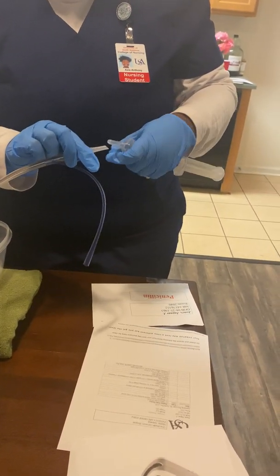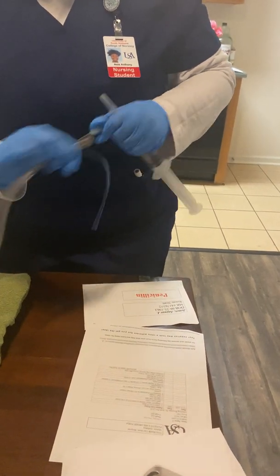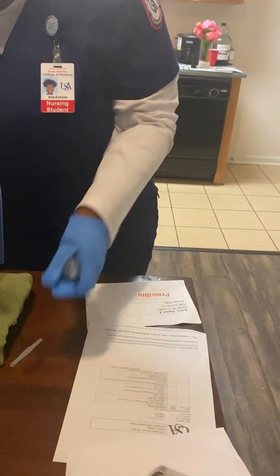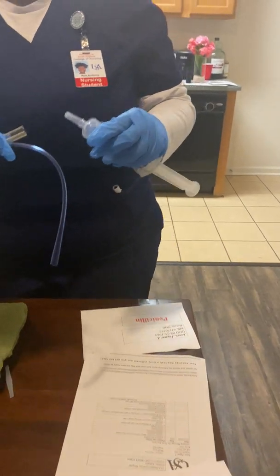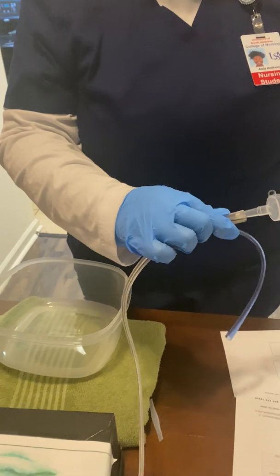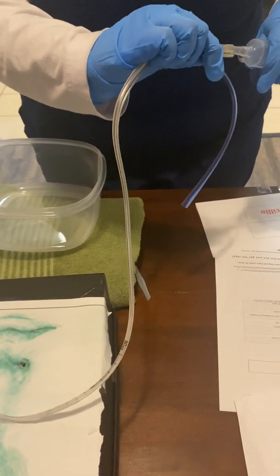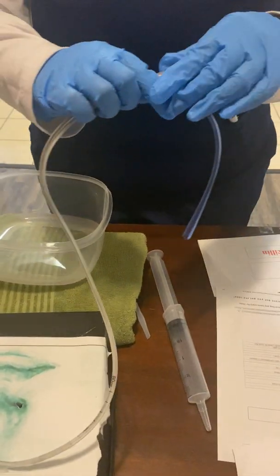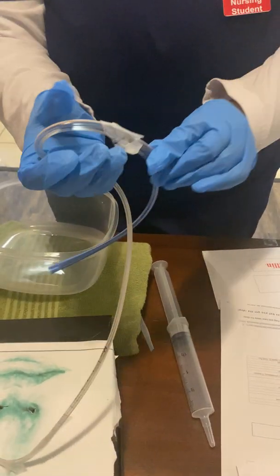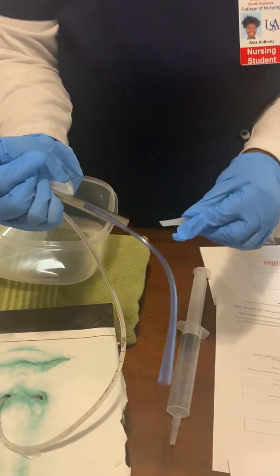And I'm going to state that now I will be going to low intermittent suctioning. So I'm going to place this here, and then I'm going to take this out. I will also make sure that this is kinked. And then I'm going to place this back in.